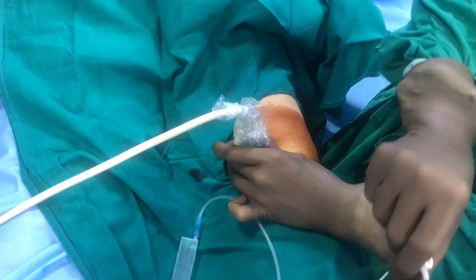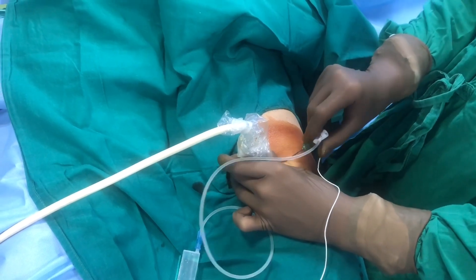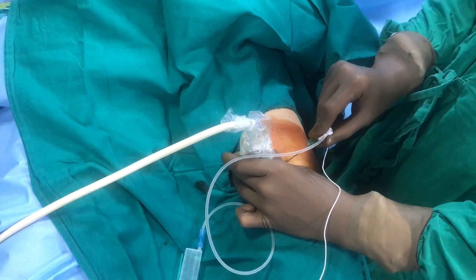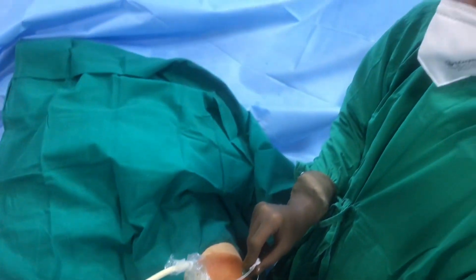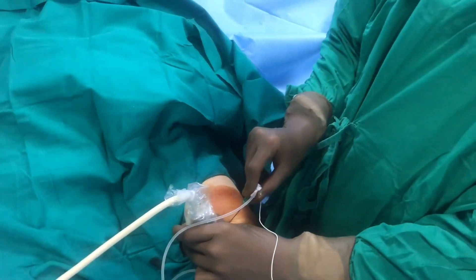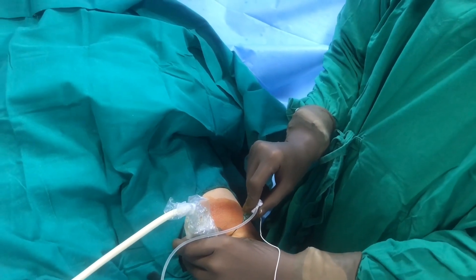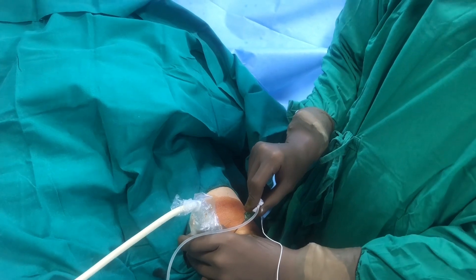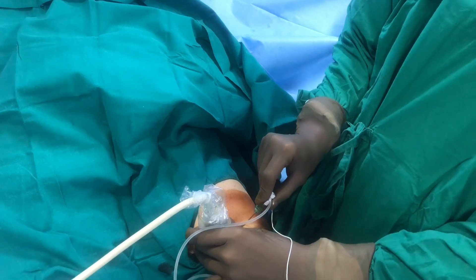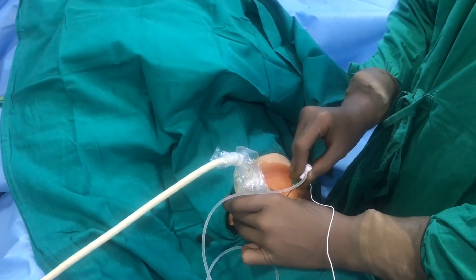This finger is my second reference point and the entry point is my first reference point. Once I go in, I don't look at the screen at all. I just focus on keeping the needle going along the plane — in the same plane as these two reference points. I am pointing my needle towards this finger. Once I have gone in, the next step is to look at the screen.